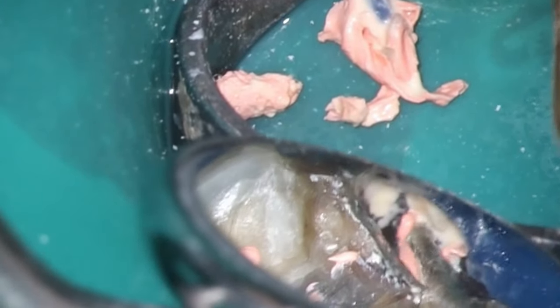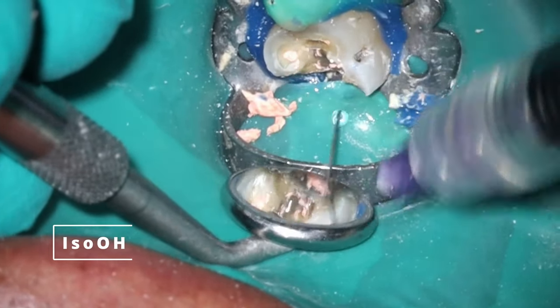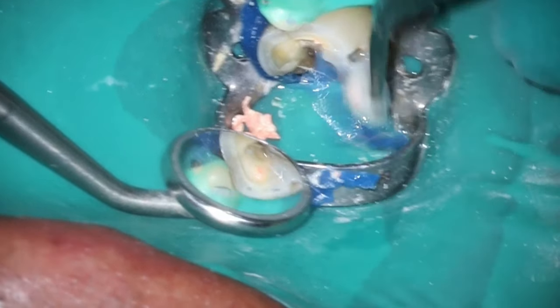You'll notice I'm flipping back and forth between the two distals — that's because when you push on one it kind of pushes up the other, so you want to go back and forth to make sure you get a really nice obturation. Backfilling that little hole in the distal lingual as well. The stabilization does kind of zoom in and out — I'm not sure if I like it; it added a lot of time to my processing, but it's something to play around with. My goal with every new video is to learn something new in DaVinci. Getting ready to take a final film — popping off the block-out since I don't need it for the actual buildup.